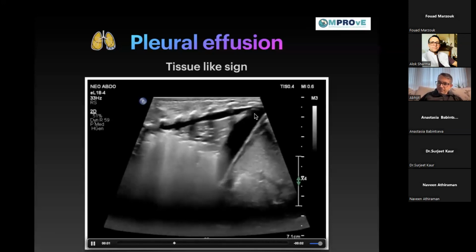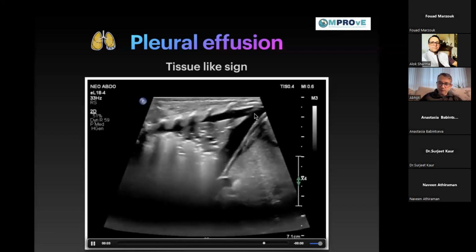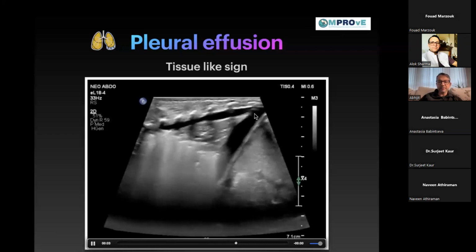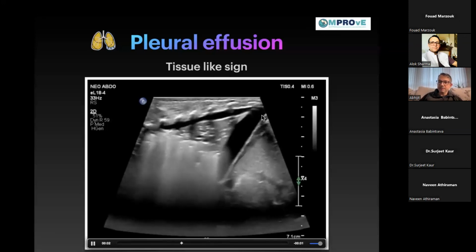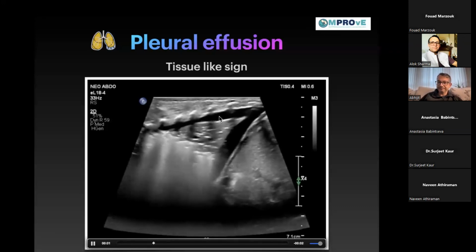When you see any abnormality, you have to do both the perpendicular and the longitudinal, which means vertical and horizontal scans. I'm sure Alok is going to talk about the basics of it, or might have spoken about it. But where to keep the probe, you just go by the standard areas we scan, and in any area where you see some kind of pathology or anything abnormal, you try to interrogate that area with both vertical and horizontal scanning.